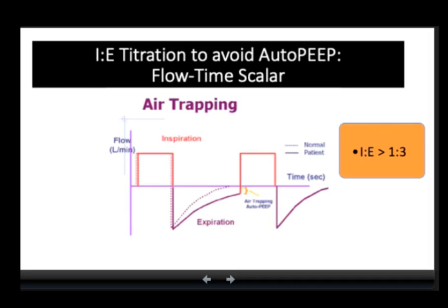The inspiratory portion has a square form, which is consistent with the constant flow rate characteristic for volume control mode ventilation. This purple portion of the waveform represents expiration. Normally, the expiratory curve goes back to the baseline prior to the beginning of the next breath, indicating that the expiratory flow ceased completely.